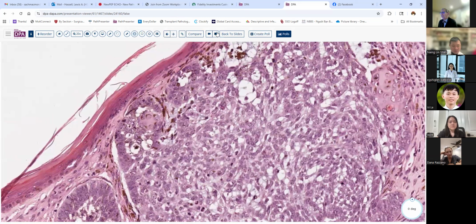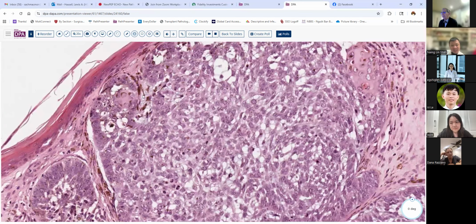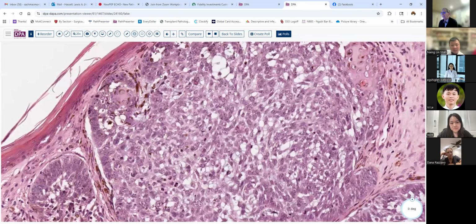I could give you controls and you could point to what you're seeing here. Let me do that. Okay, I've given you keyboard controls, so you can move to the area and maybe use your mouse to point at what you think is the abnormality.